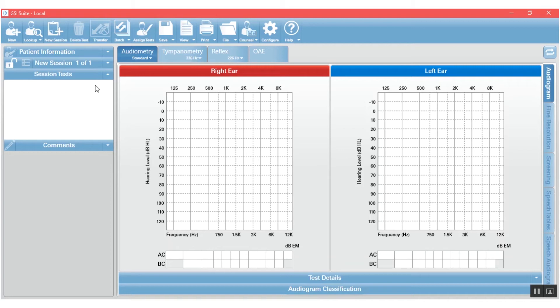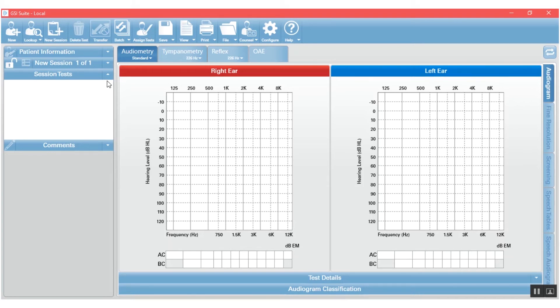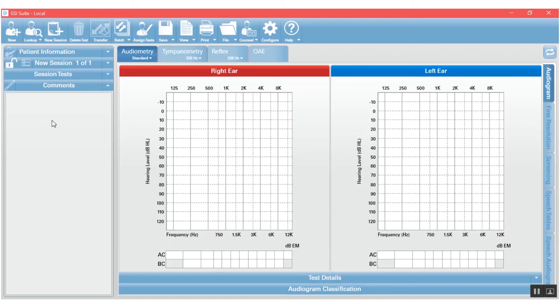The third section of GSI Suite is this session test. And when you have a patient loaded, it will actually list all the different tests that you have taken or transferred from the GSI equipment. And then the final sections here is the comment section. And this is where you will write your report to be displayed on the report when you are finished with the patient.